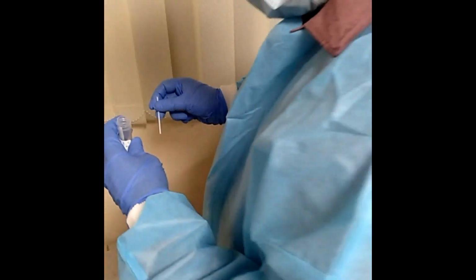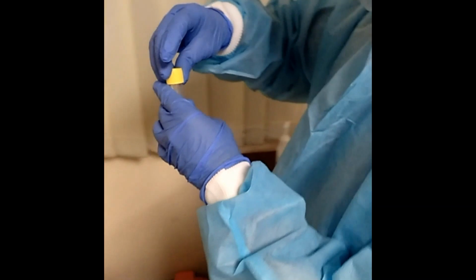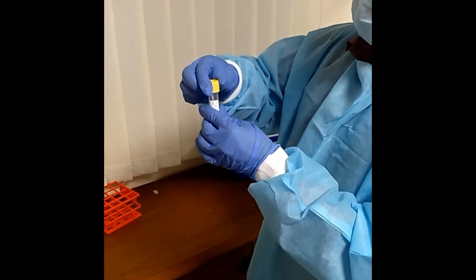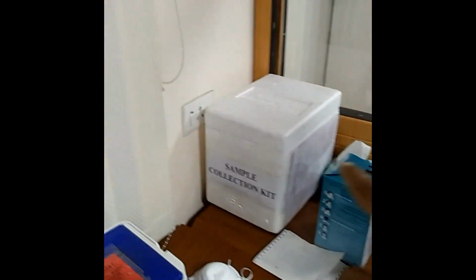Place swab immediately into the VTM and cut the swab applicator stick below the level of neck of the VTM vial to ensure proper tightening of the cap.